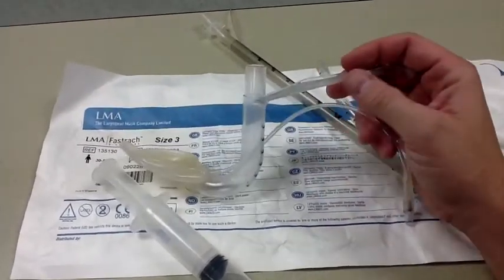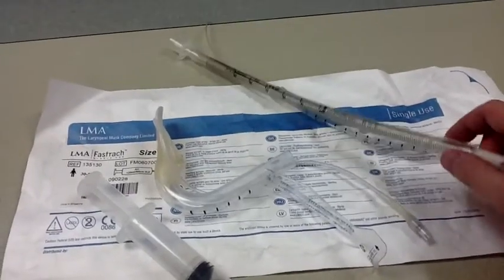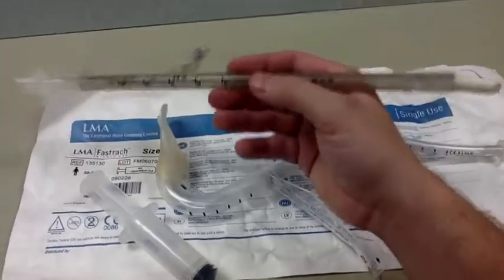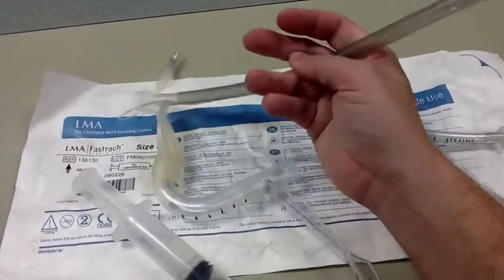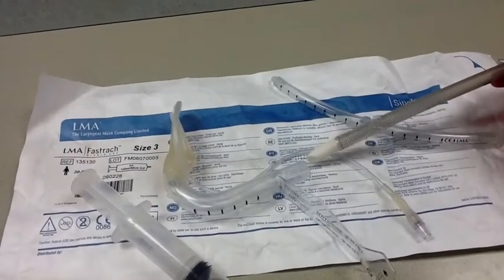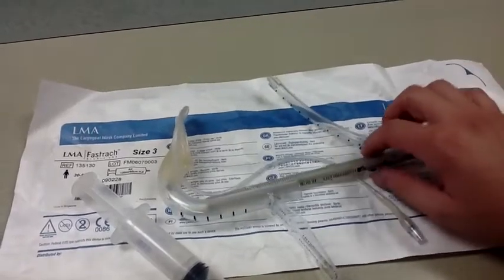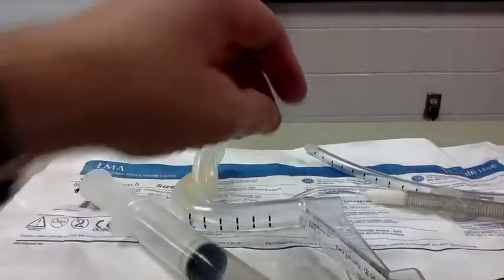After the LMA has been inserted, the package also includes an endotracheal tube — it looks like this. It has a wire internal structure that gives it some strength while still being malleable. This tube is designed to be inserted blindly into the LMA.